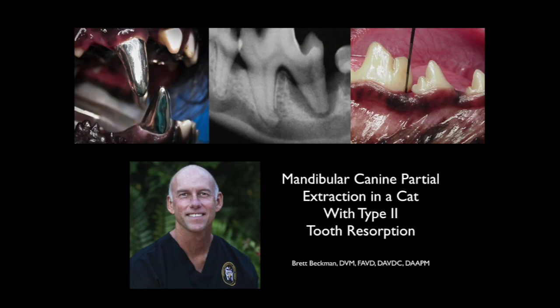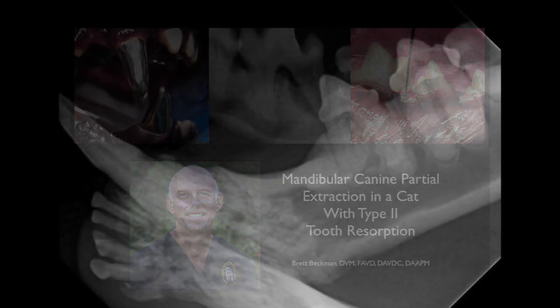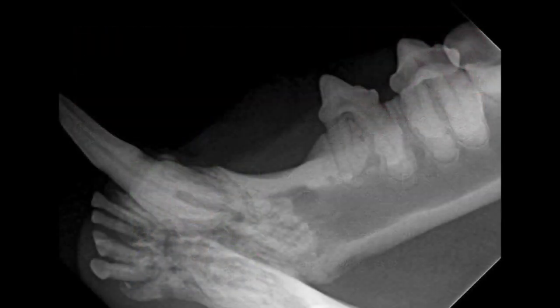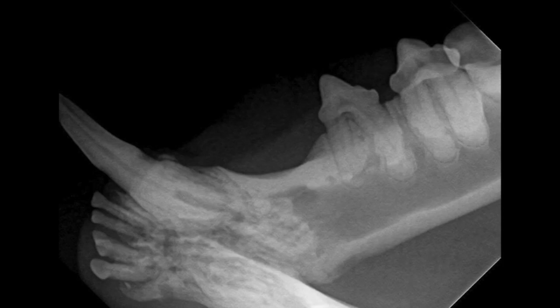This video will demonstrate the partial extraction of a mandibular canine tooth in a cat that has tooth resorption. On the radiograph, you can see there is obliteration of the periodontal ligament space and replacement with bone going on in about the apical one-third of that tooth root.